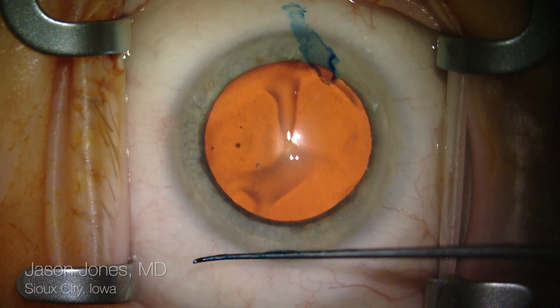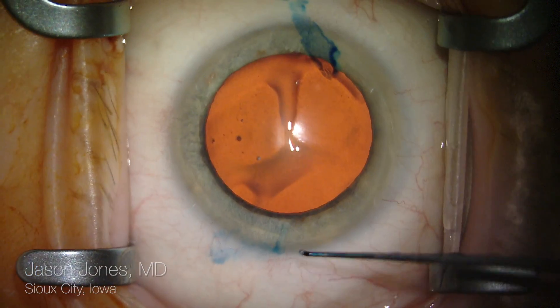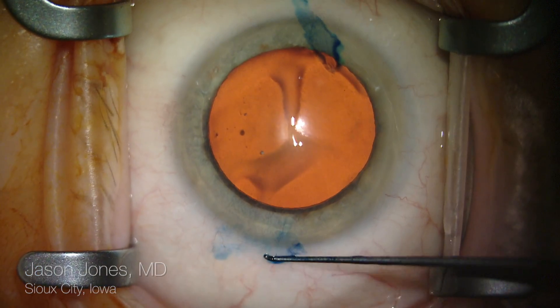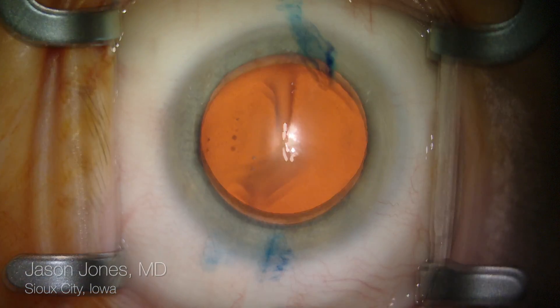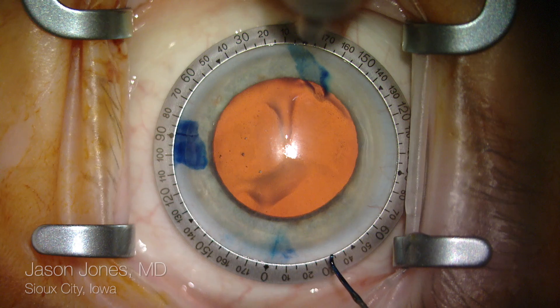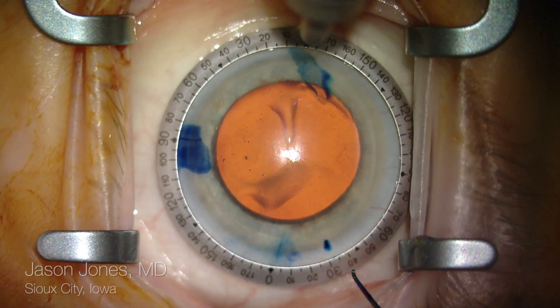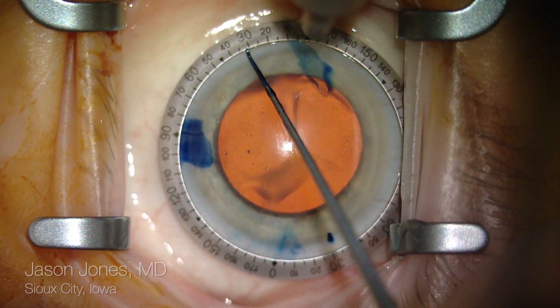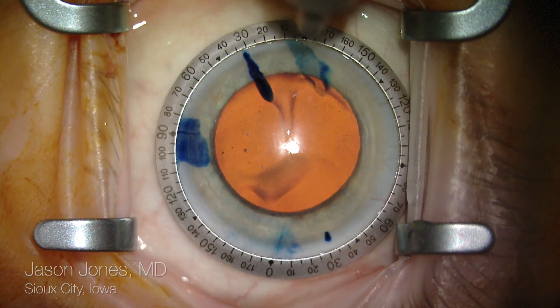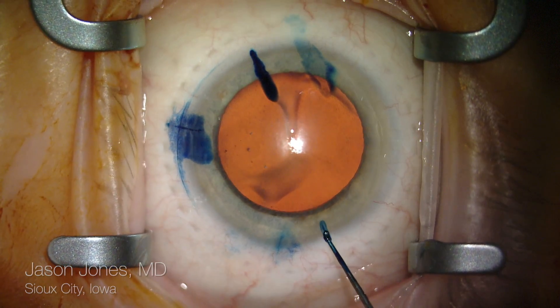I've marked the limbus using a dry SENSKY at the slit lamp preoperatively at the three, six, and nine o'clock positions. I'm using a new fresh SENSKY in the operating room loaded with methylene blue dye from an ink pad to delineate the reference marks from the slit lamp, and then a Mendez ring to orient my marks.